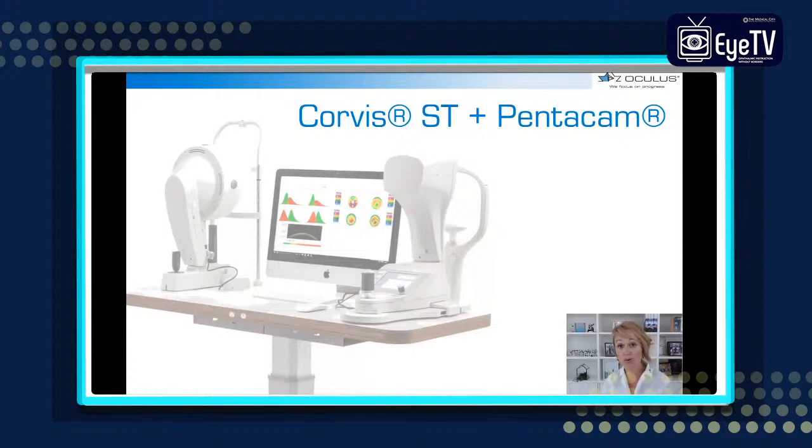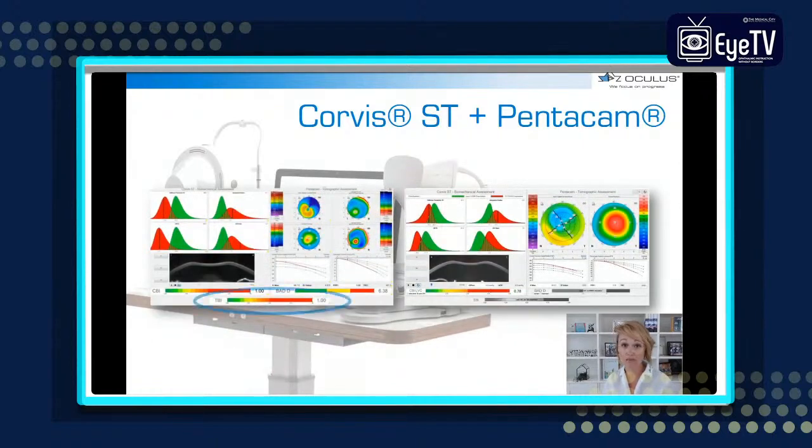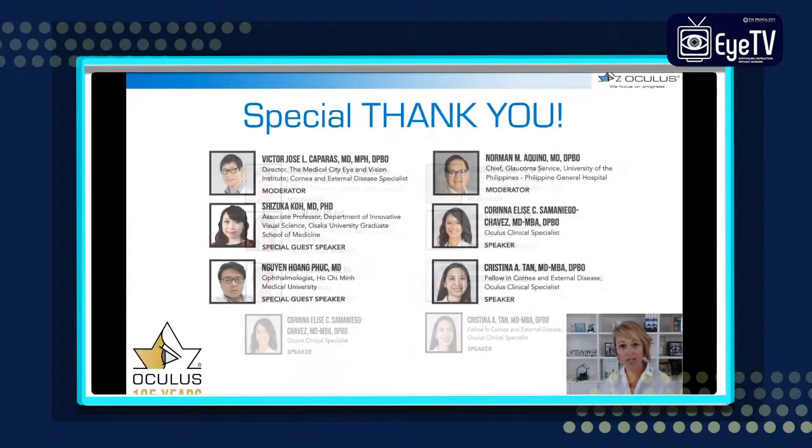Raw data from both these devices is incorporated in a random forest approach, generating the TBI, or Tomographical Biomechanical Index, for ectasia. A new feature is also the LVC-CBI, which monitors the stability of the cornea post-refractive surgery.